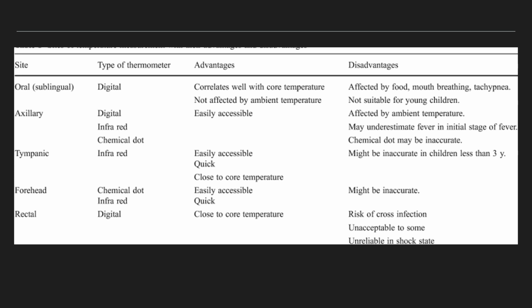Oral. The most common site for temperature measurement is the mouth. Advantages of the oral route include easy access and client comfort. Drinking hot or cold liquids can affect temperature measurement. Wait 15 to 30 minutes to allow the client's mouth temperature to return to baseline before placing the thermometer. Oral temperature assessment may not be prudent or safe for infants, young children, unconscious or irrational clients, or clients with seizure disorders.